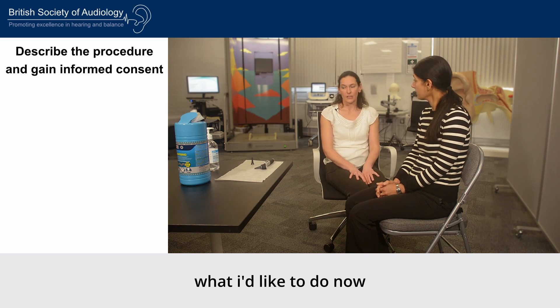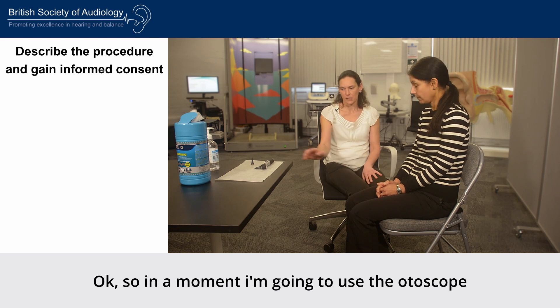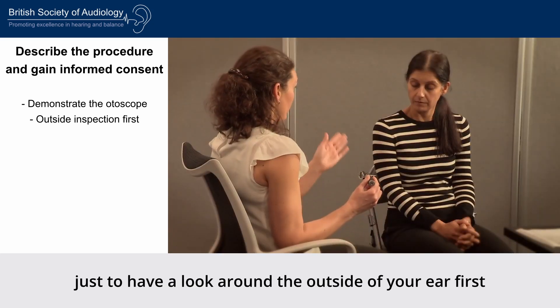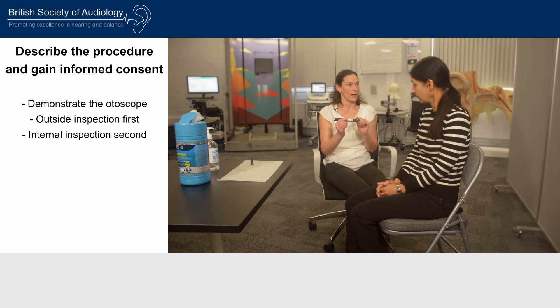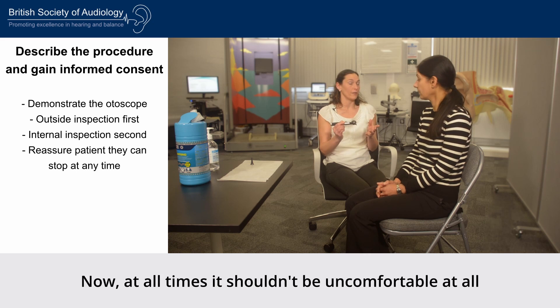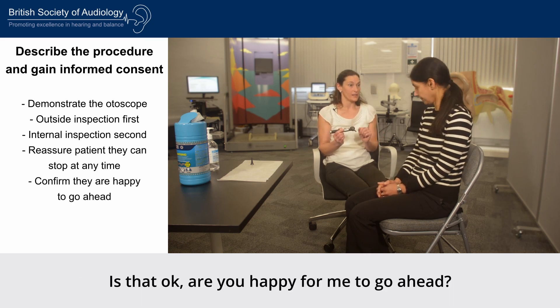With your permission, what I'd like to do now is have a look in and around your ear. I'm going to use the otoscope, which is a light with a magnifier, to look around the outside of your ear first and then gently go into your ear. At the same time I'll pull your ear up and back with my other hand. It shouldn't be uncomfortable at all, but if it is for any reason just let me know and I'll stop. Are you happy for me to go ahead? That's fine.